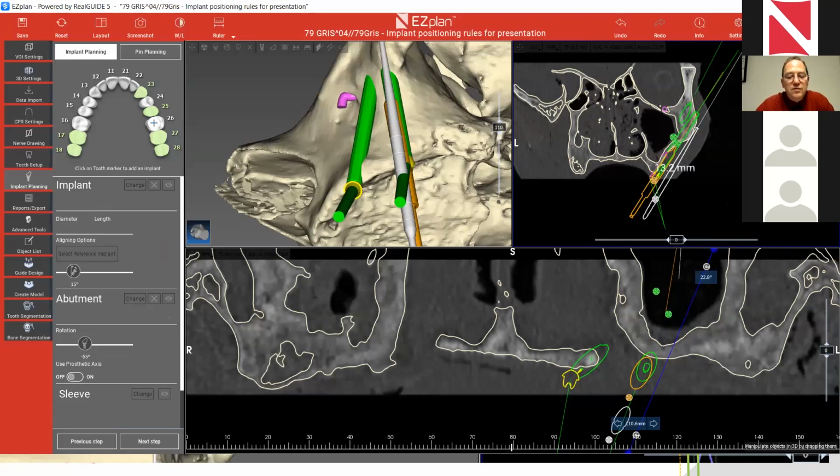Demetrios, are you always operating under general anesthesia, or can you place the zygomatic implant under local as well? Well, general anesthesia is much better because the patient doesn't interfere with what you're doing. Under local anesthesia, it would be quite difficult for the patient to tolerate this procedure.